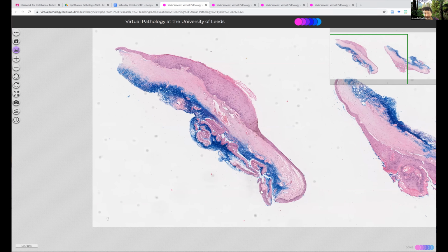So epidermis, and then what looks like dermis to me. It's got this very strange bluish purple homogeneous look. And when I go closer in, I can see it's got these little wiggly worms. How good is this? This looks like solar elastosis. So these are elastotic fragments of severely sun-damaged skin. So I think this is sun-damaged skin. So Amanda, if this is sun-damaged skin, where are the skin adnexa?